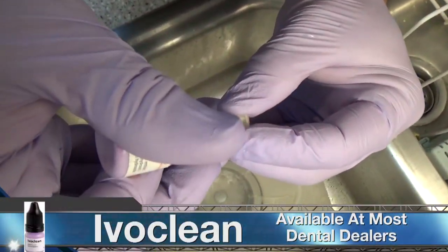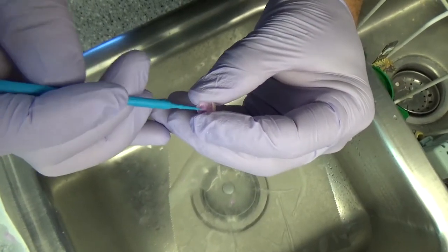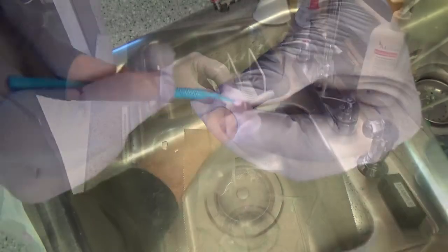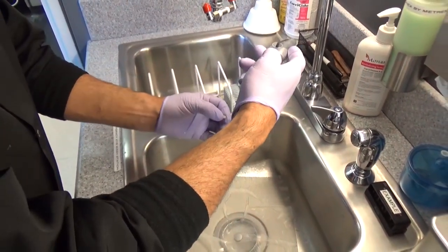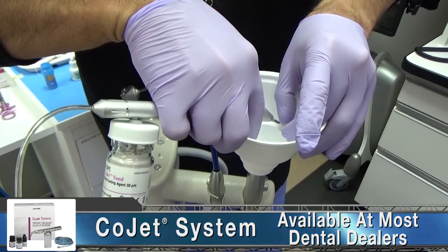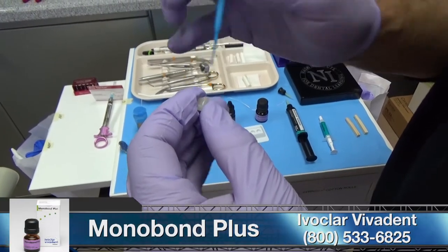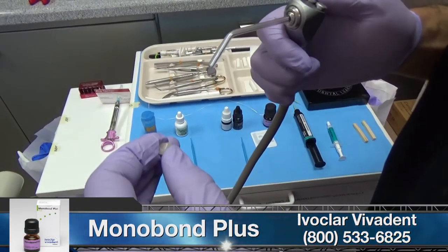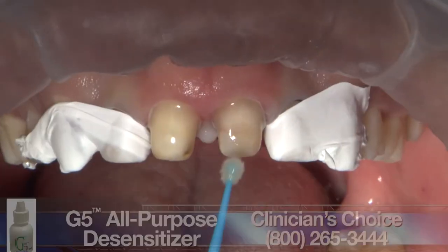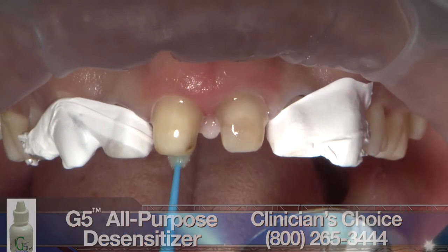When preparing the intaglio surfaces of the Bruxer anterior restorations, my assistant is initially scrubbing the intaglio of the crowns with IvoClean. This universal cleaning aqueous solution from Ivoclar effectively cleans the bonding surfaces after intraoral try-in and creates optimum prerequisites for the Multilink Automix adhesive luting cement. As an additional step, each unit is also prepared with a blast of CoJet sand for silicization of the zirconia surface. Finally, each unit is scrubbed with a layer of Monobond Plus for 1 minute and lightly air-dried. Before applying the MDP primer to the preps, I like to use G5 from Clinician's Choice as a standard in my practice.